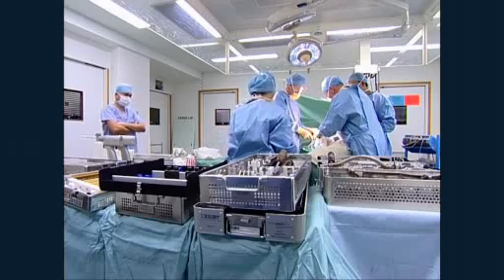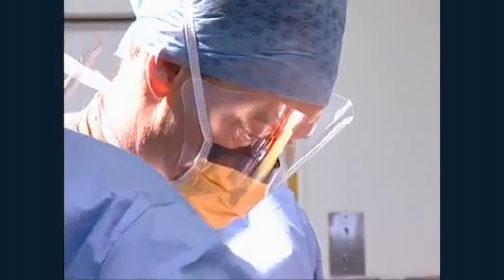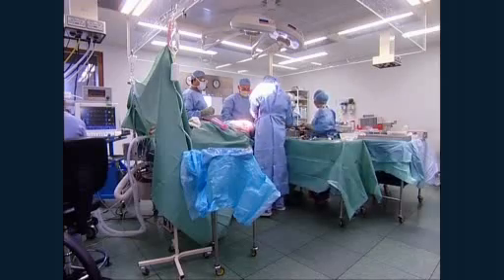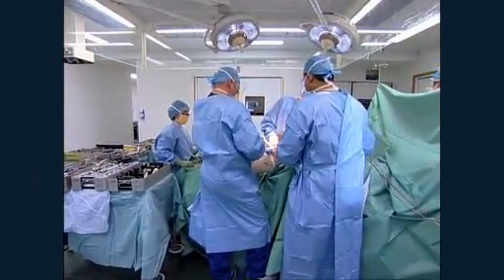It's important to do an incision where we can do the operation safely. We aim to do it through a small incision, but a safe incision, and thereby reduce the damage to the tissues. This should speed up the patient's recovery time. No matter which surgical approach is taken, you will be part of the Rapid Recovery Programme.